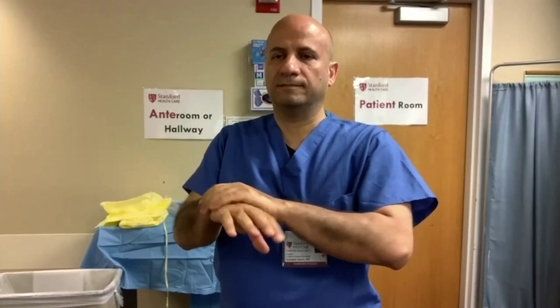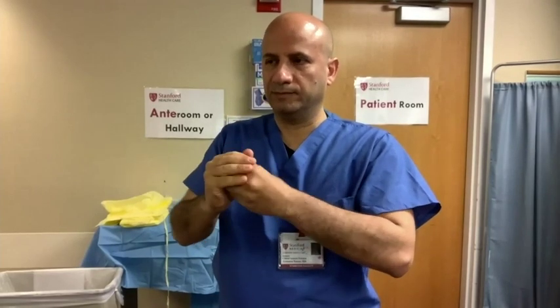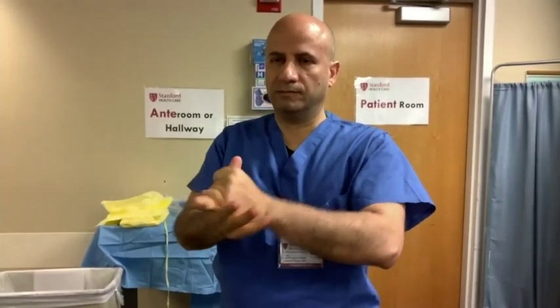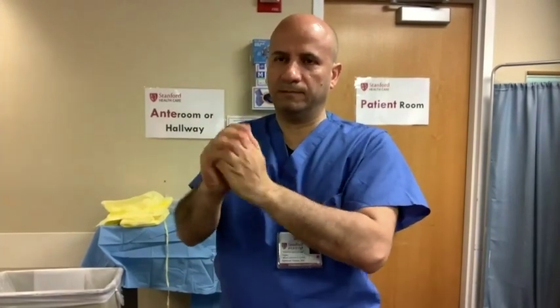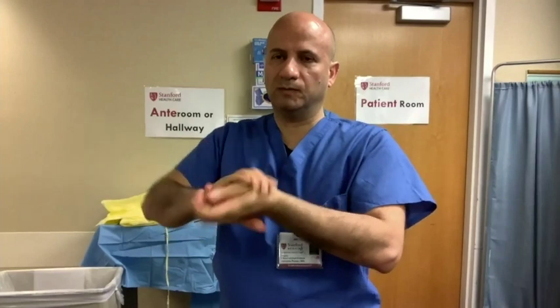Next, rub palm to palm with your fingers interlaced. Then rub the backs of your fingers on one hand to the opposing palm with fingers interlocked and vice versa. Then make sure that you get your thumbs using a rotational motion. Finally, clean underneath your fingernails and nail beds and continue rubbing as they dry.